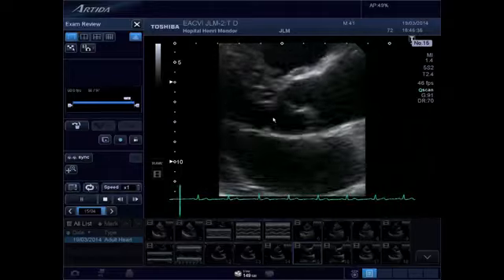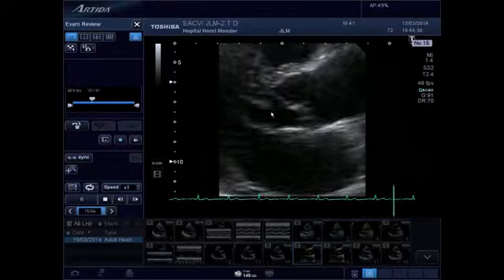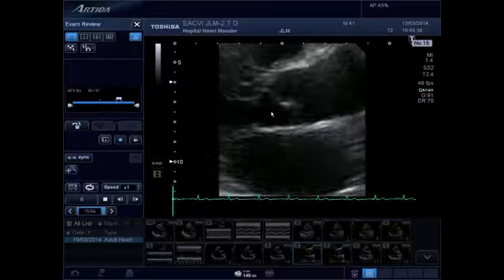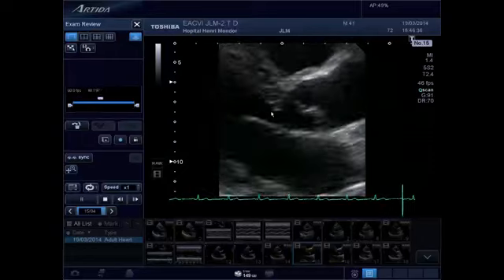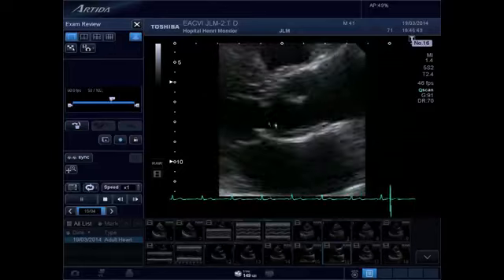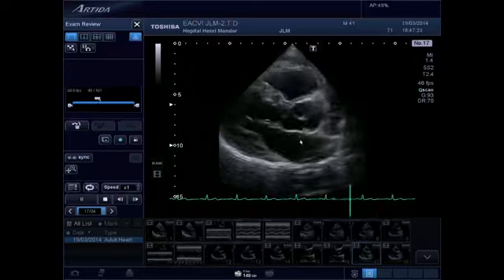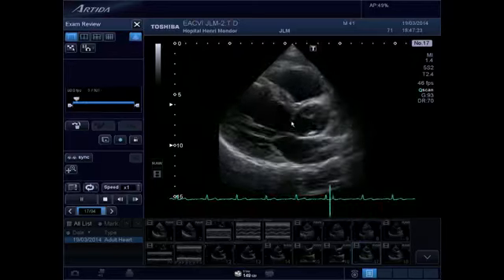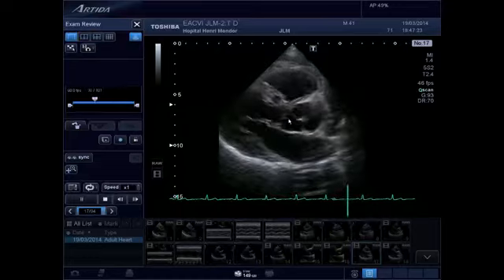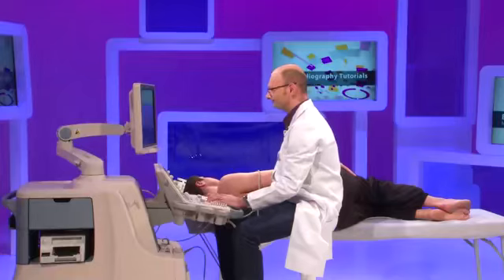And we can also see the membrane in the outflow tract, which is not clearly visible because, as you can see, the membrane is parallel to the ultrasound beam, and in this case, the definition is not good. So here you can see a little better the membrane, but still not clearly visible. And if you change the plane to go on the border of the outflow tract, you can see a little bit more easily this membrane in the left ventricular outflow tract.